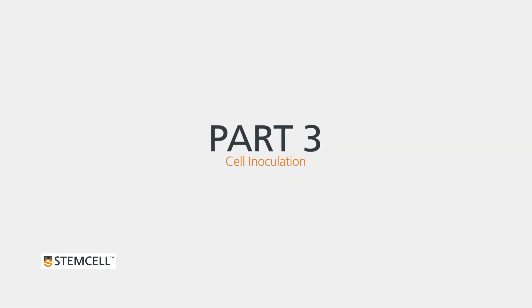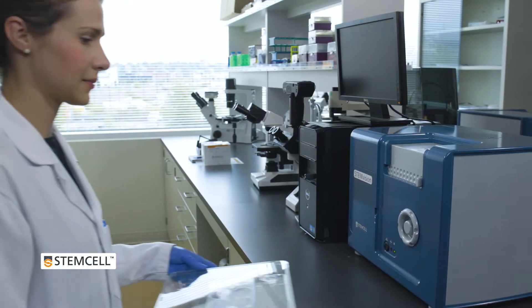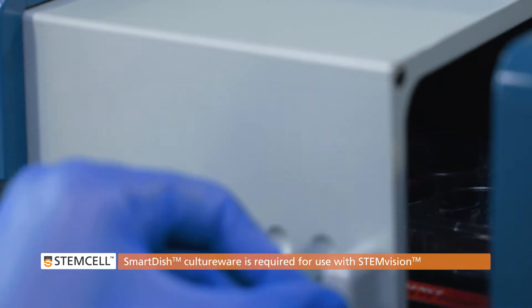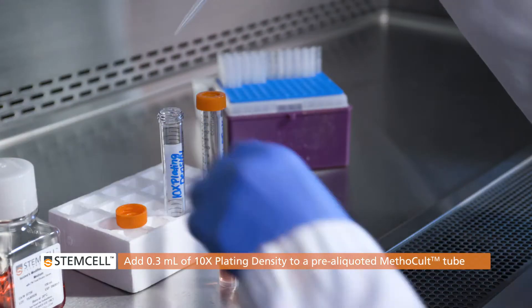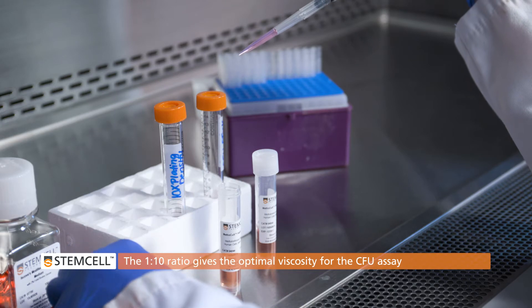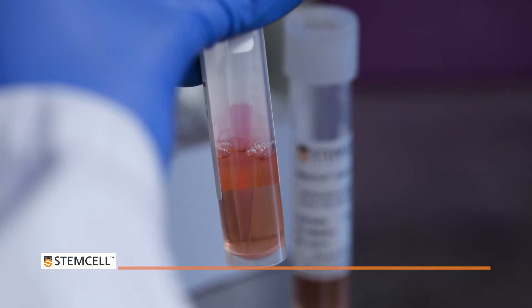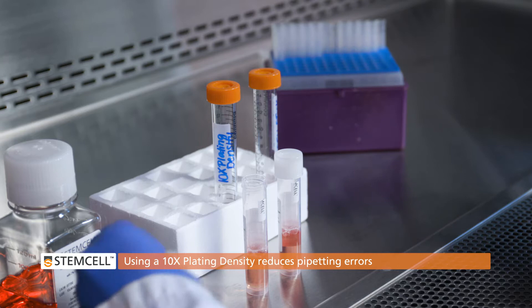Part 3: Cell Inoculation. SmartDish 6-well plates can be used as an alternative to traditional 35-millimeter dishes. SmartDish culture ware is required for imaging and the automated counting of colonies with STEMvision. For duplicate assays, add 0.3 milliliters of 10 times plating density to a pre-aliquoted 3 milliliters Methicult tube. This 1 to 10 ratio of cells to medium gives the correct viscosity to ensure optimal CFU growth and morphology. Using a 10 times plating density to prepare the final plating density reduces pipetting errors.